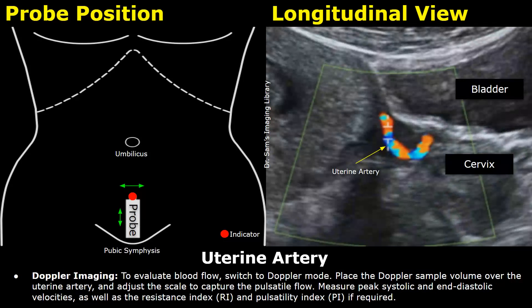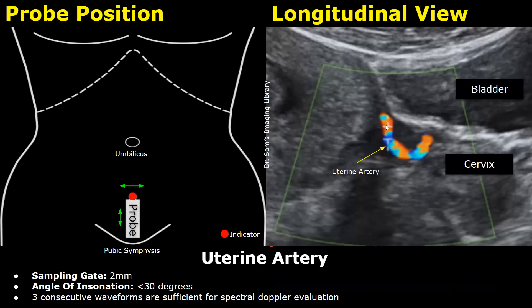After you have located the arteries using color Doppler, you can then place a sample volume over this pulsatile flow for spectral Doppler analysis, so you can measure peak systolic velocity, end diastolic velocity, resistive index, and pulsatility index, and then you can calculate the S/D ratio. Make sure that the sample volume covers the lumen of the artery. The sampling gate size is usually two millimeters. The angle of insonation should be less than 30 degrees so you can get accurate spectral Doppler values.